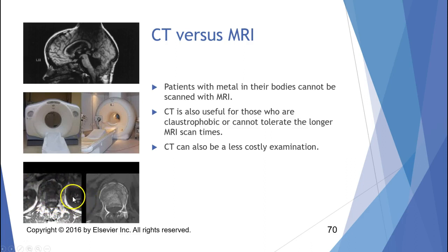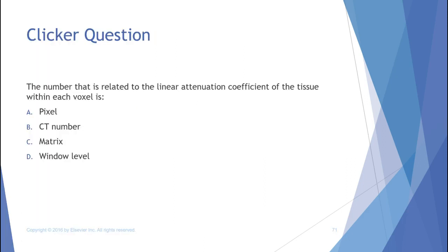You see the kidneys really good. You see all these muscles going through really good. And you see the spinal cord really good. But what you don't see really good is the fracture of the bone. When you come over here to CT, it is gorgeous. Look at those fractures. So they're all right there. Okay, so CT is very useful for that kind of thing.